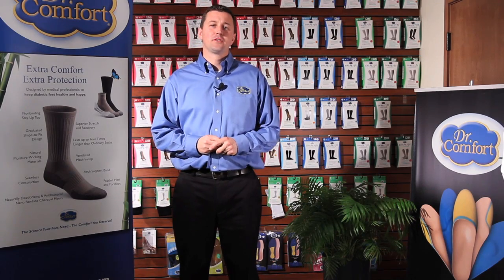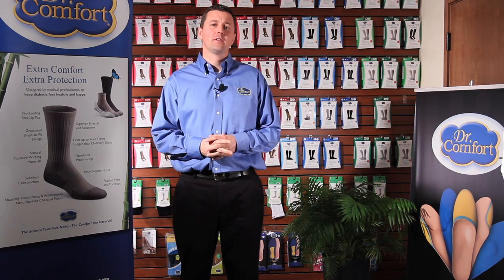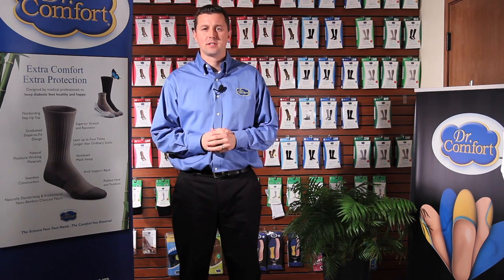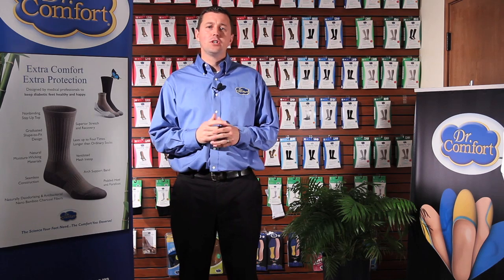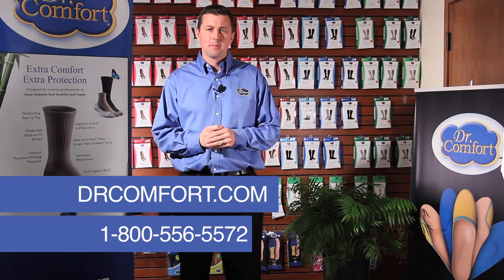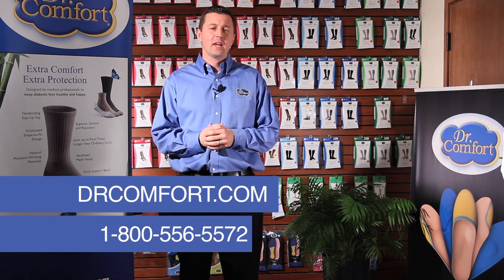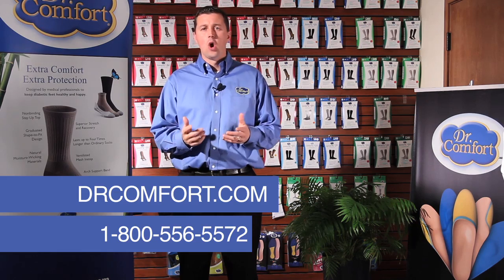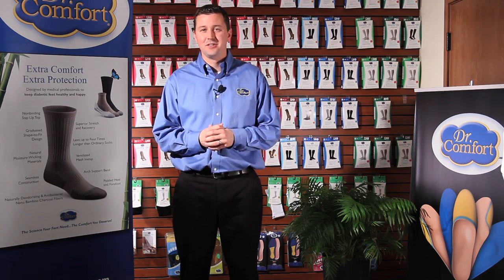You can expect Dr. Comfort's Shape-to-Fit line of compression wear to be the same superior quality as the other Dr. Comfort products. We hope this video was helpful to you and your patients. Please contact Dr. Comfort at www.DrComfort.com or call 1-800-556-5572 for any questions or to order any of the products you saw here. Thank you.